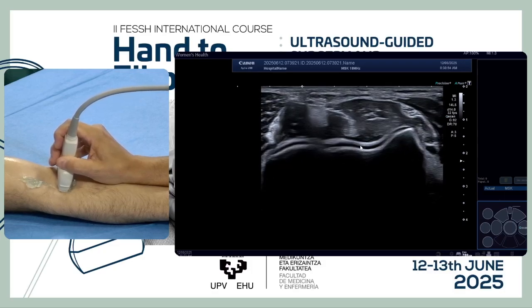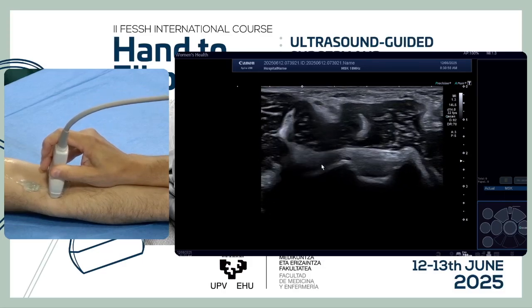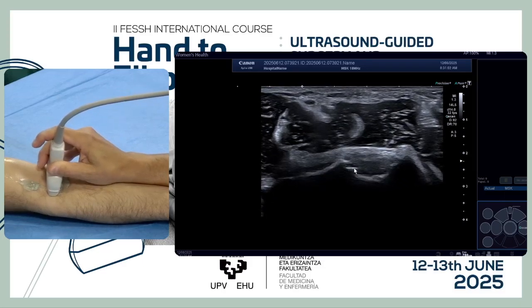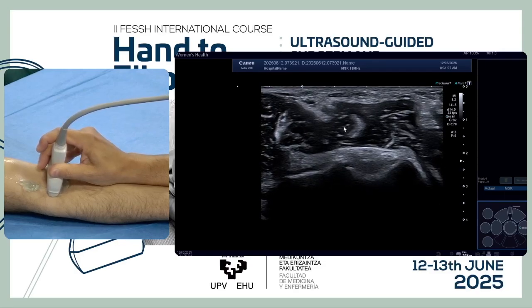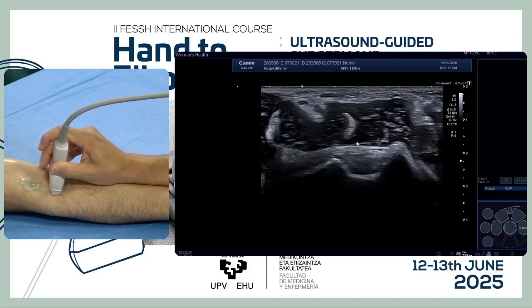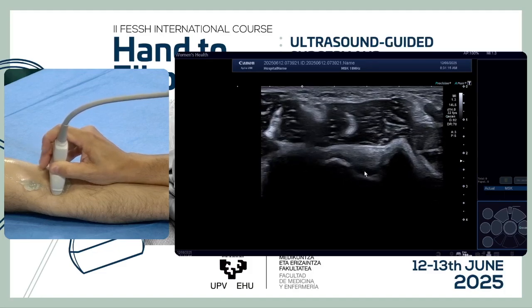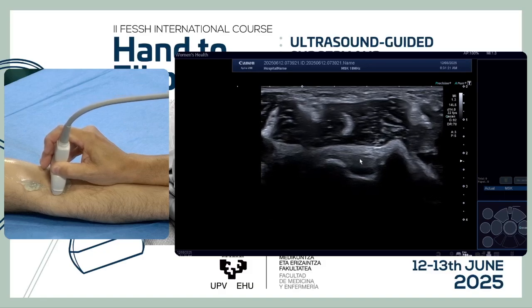Overlying the cartilage, if we move proximal, we see the two recesses — the radial recess and the coronoid recess, usually bigger — and overlying the capsule between the joint and the muscle. The recesses can be really deep, and overlying between the capsule and the recess, we see the fat pad.